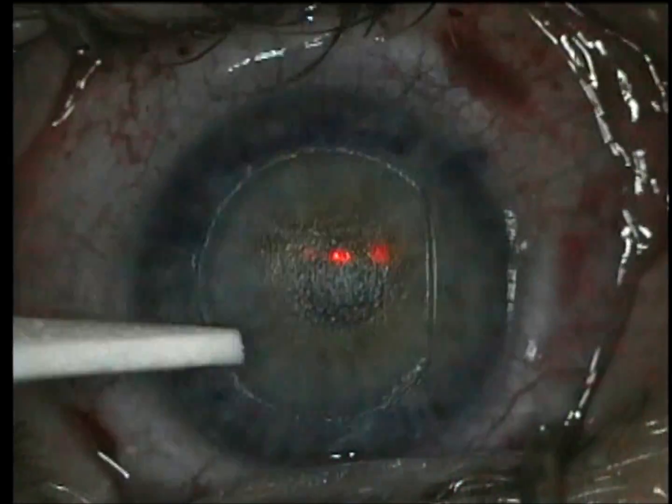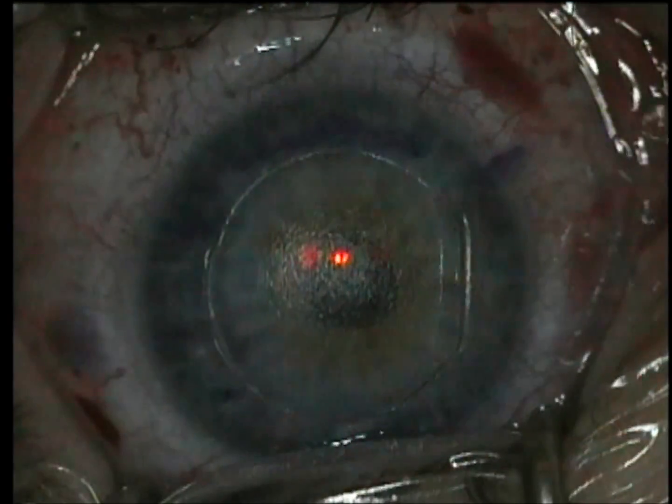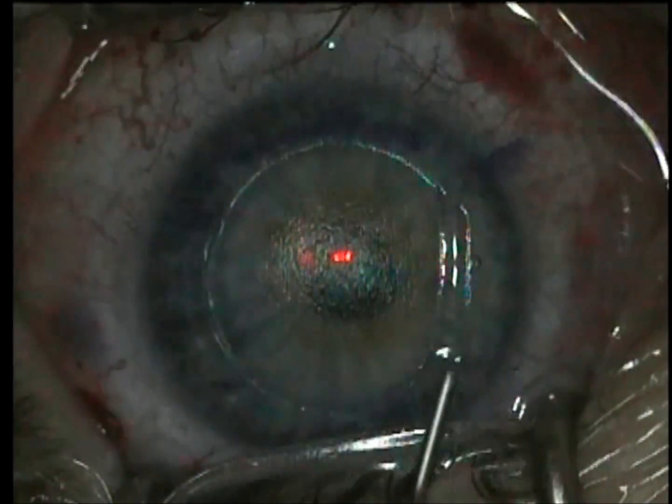We get a nice clean new looking intralase flap edge, which decreases the rate of epithelial ingrowth.